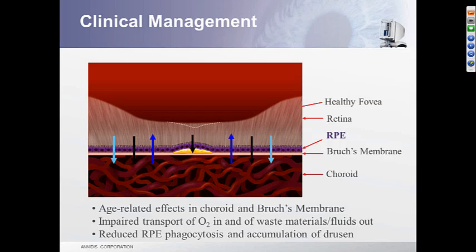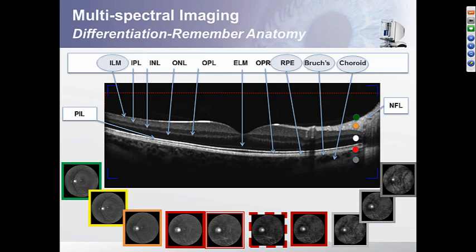When you go through the multispectral images, keep anatomy in mind. The upper layers of the retina are clear. The RPE is pigmented, and the choroid is highly full of blood vessels. And I'll walk you through that in a little bit more detail momentarily here. So you're not exactly peeling away the individual layers of the retina with each different spectral slice, but you are differentiating and moving what you can see above RPE, RPE, below RPE in a very general sense, okay?